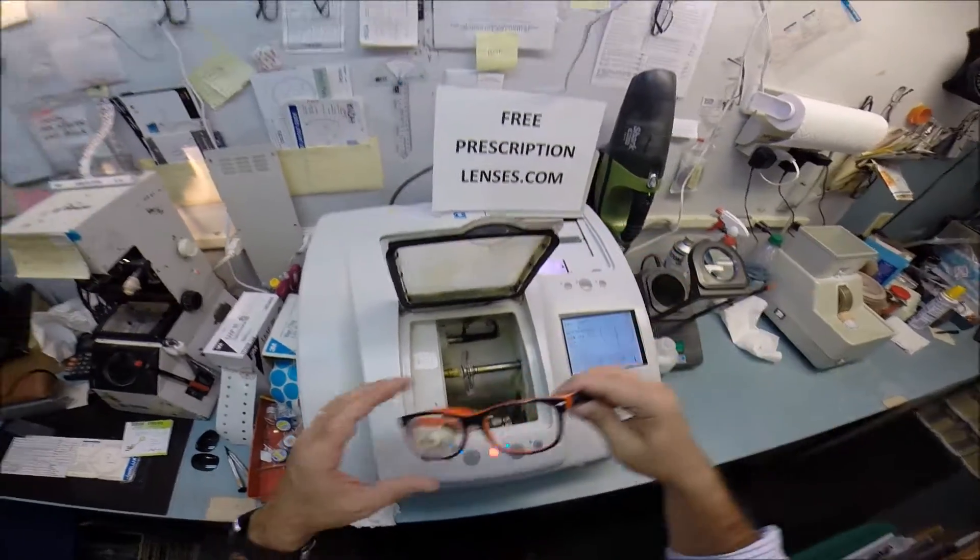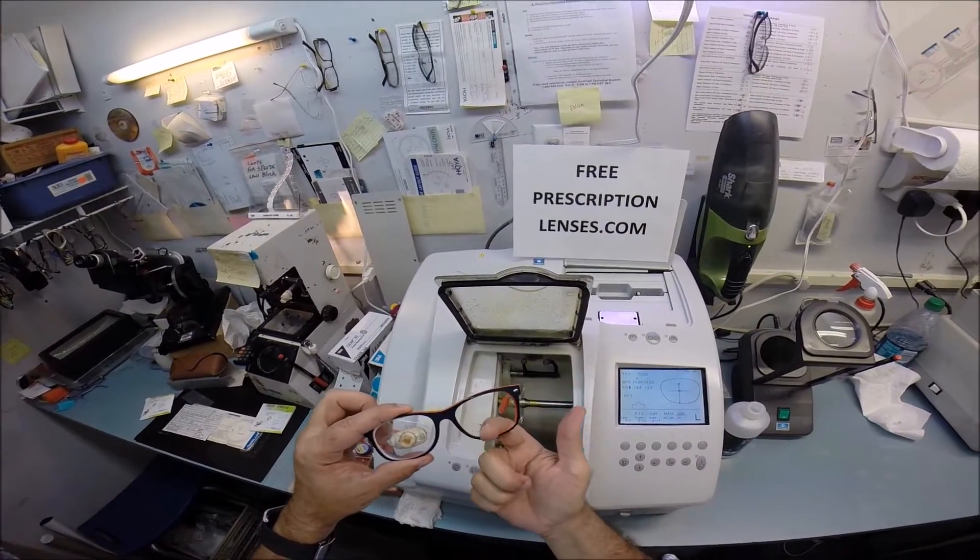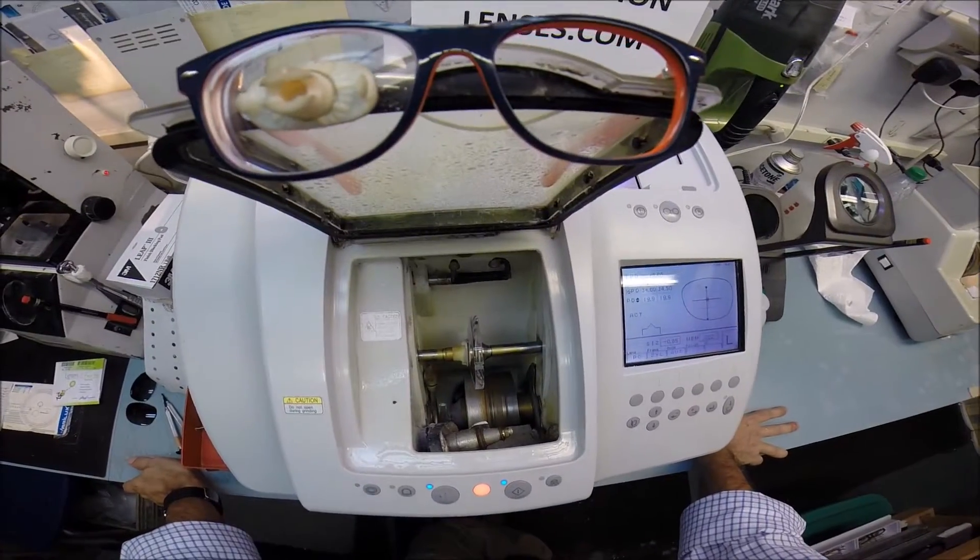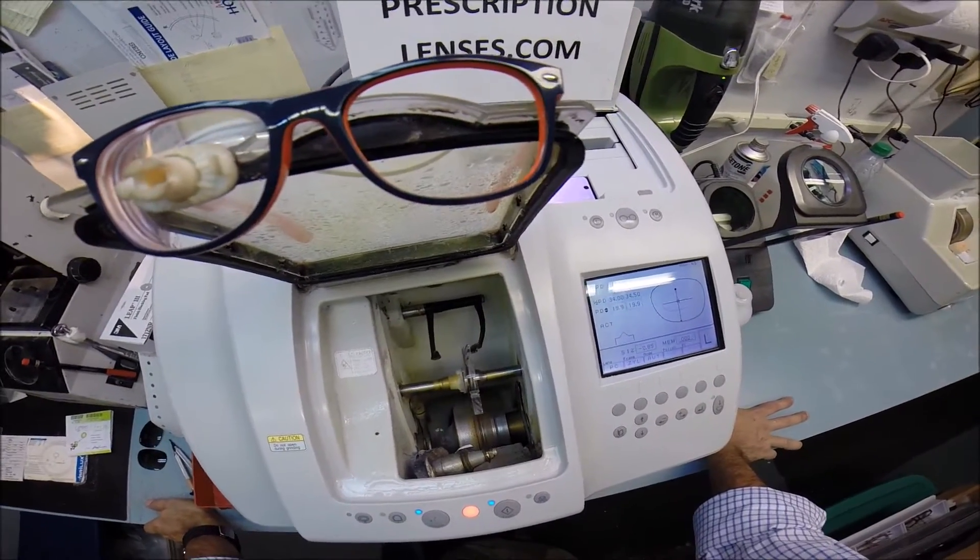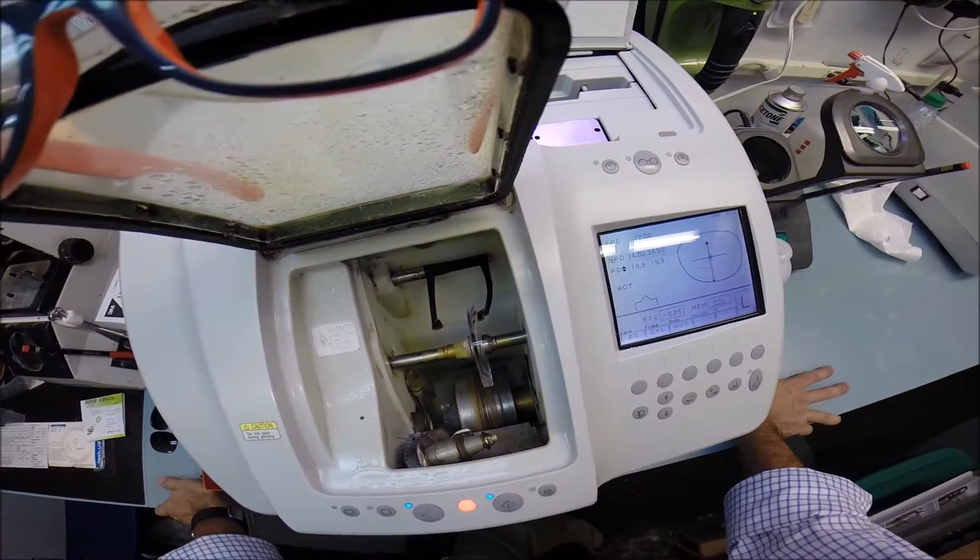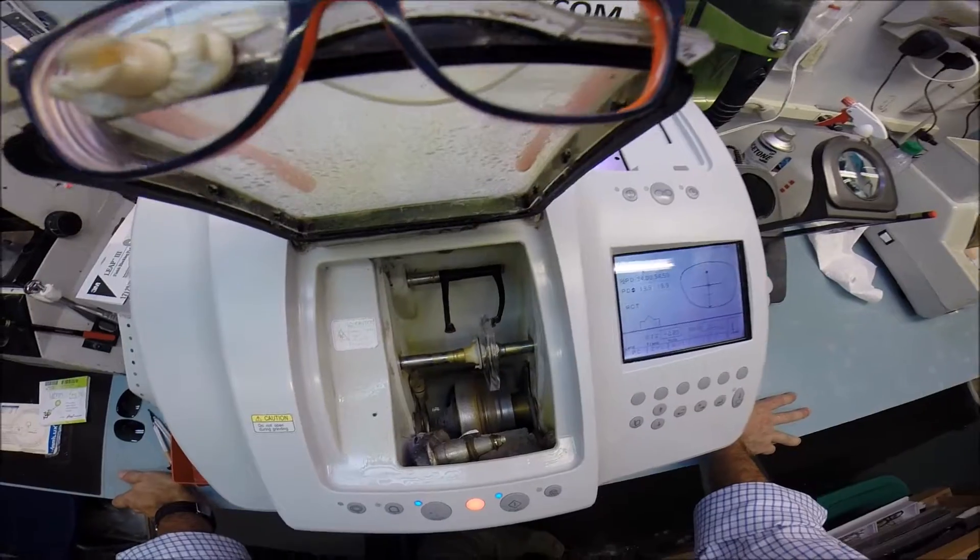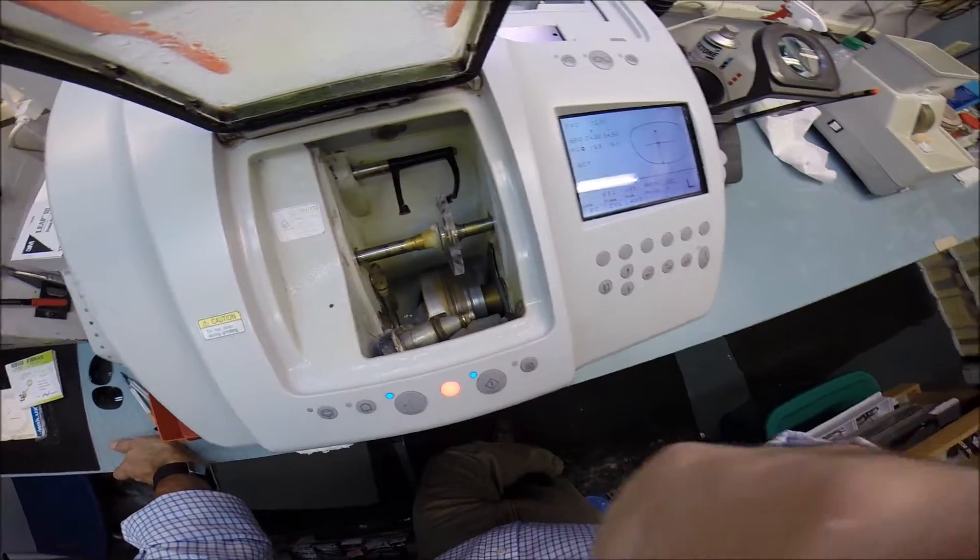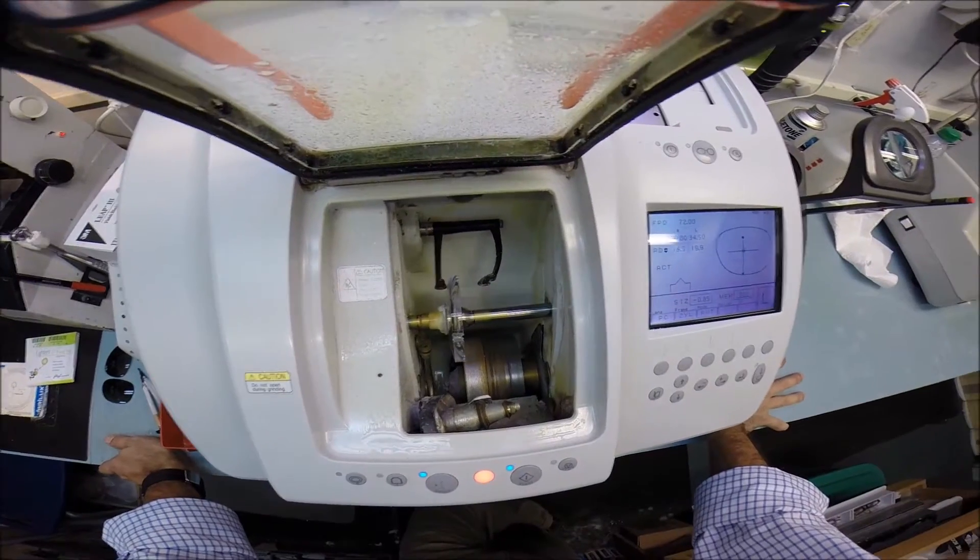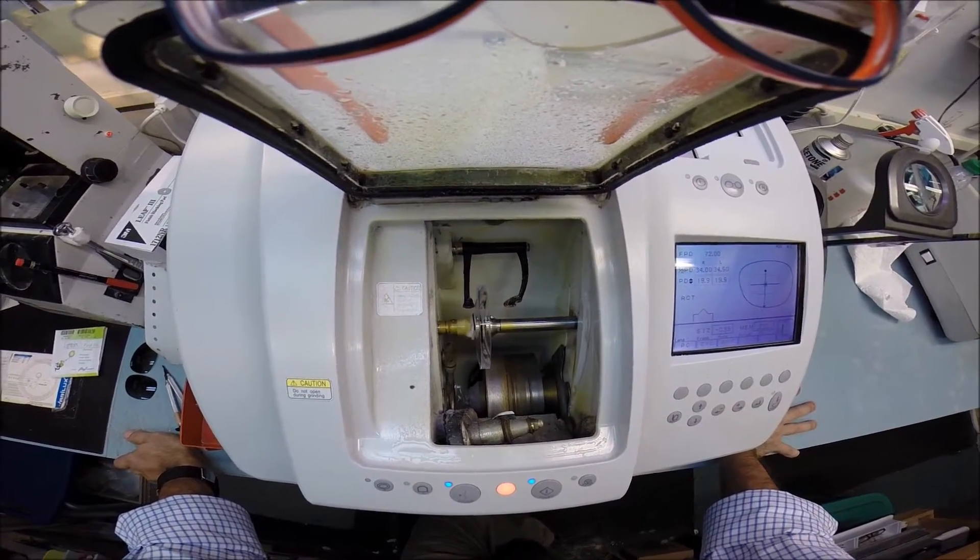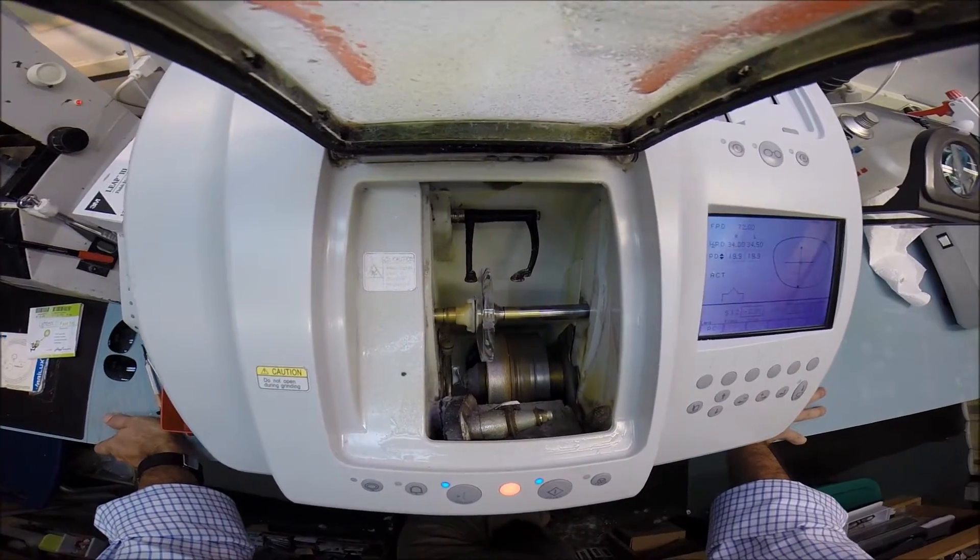And the calipers are going to come down. But this time, they're going to trace the shape of the left side of the frame to make sure the lens is large enough to fit. Always starting with the rear surface, the concave surface first, which is closest to the eyelashes. Then it will move forward and trace the convex front surface of the lens.